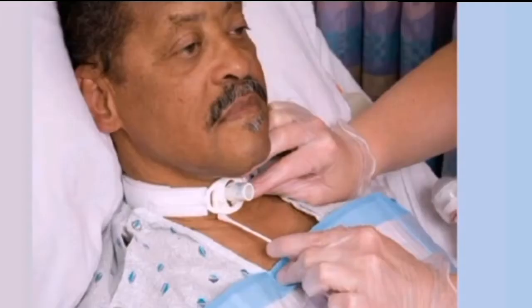Pick up the new inner cannula with your dominant hand, stabilize the base plate with your non-dominant hand, and gently insert the new inner cannula into the outer cannula. Press the tabs to allow the lock to grab the outer cannula. Reapply the oxygen source if needed.